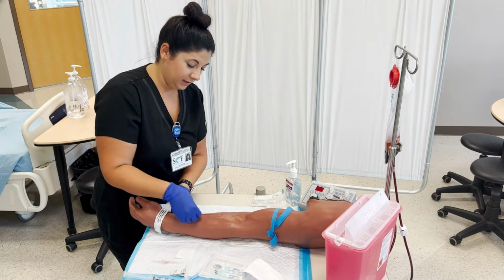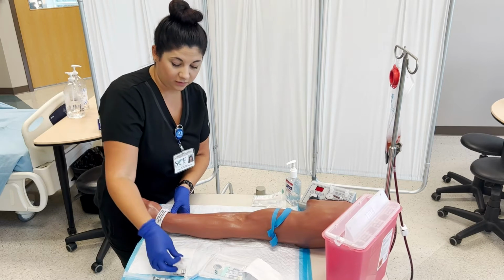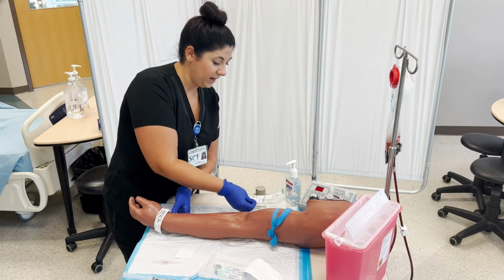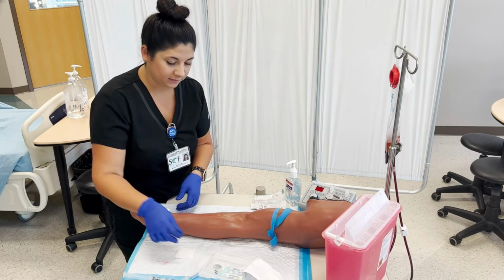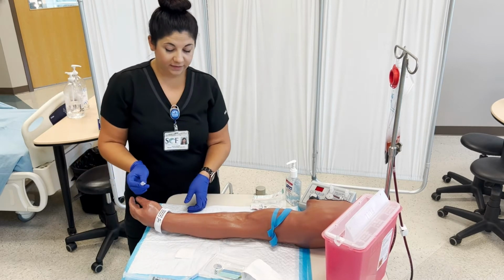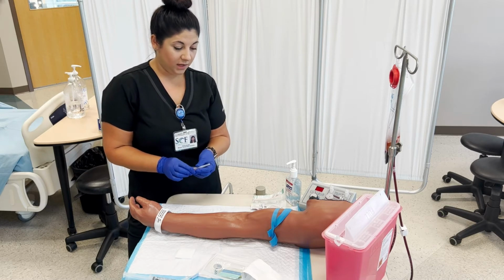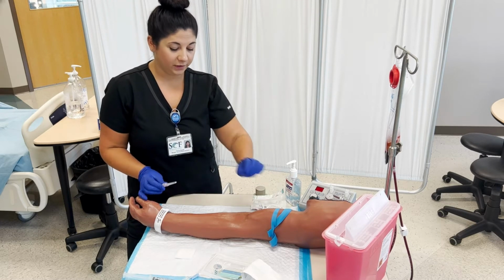We'll go ahead and clean the site up and down. I'm using alcohol. You might have something else in your kits. We'll let that dry. Make sure that your patient is comfortable with the tourniquet.